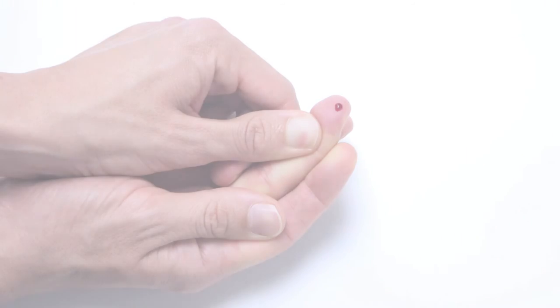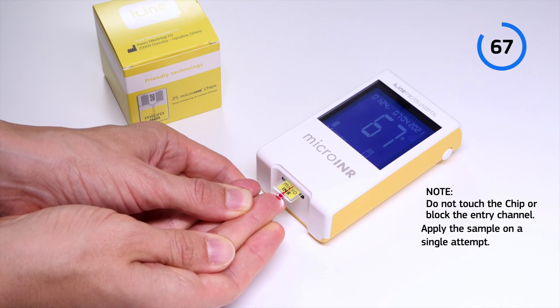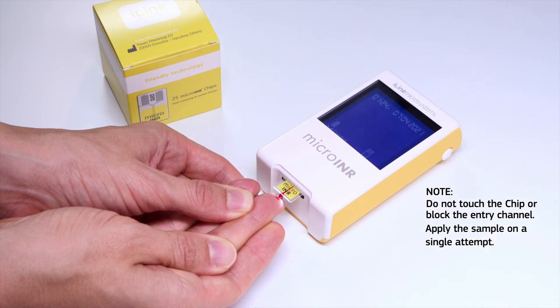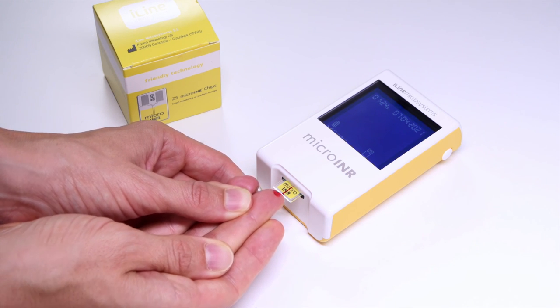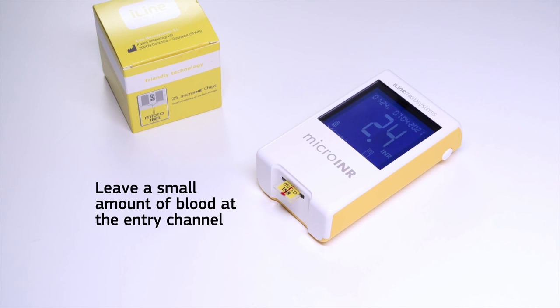Apply the drop of blood to the chip immediately. Put the drop in contact with the chip's entry channel. The meter will emit a beep tone when it detects that the sample volume is enough, the drop symbol will stop flashing, and the countdown disappears. After the beep tone, gently remove the finger, leaving a small amount of blood at the chip's entry channel.